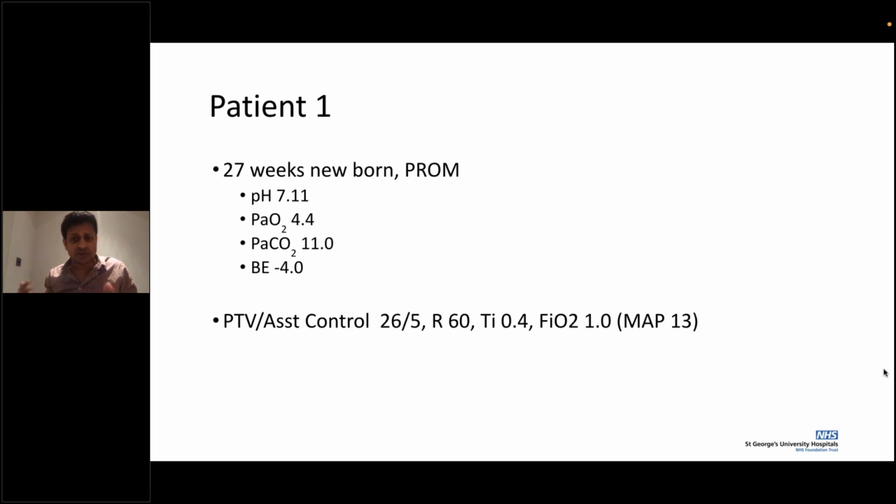And of course, pneumothorax, hopefully not in high frequency unless you're giving too much MAP. Yes, 15 is high, but the whole idea in high frequency is that you're using low tidal volume. The whole idea is that with conventional ventilation you're not going up and up to blow a pneumothorax. Yes, pneumothorax can happen in any of these babies.